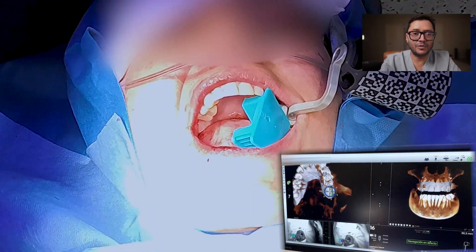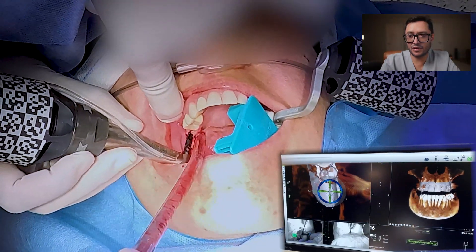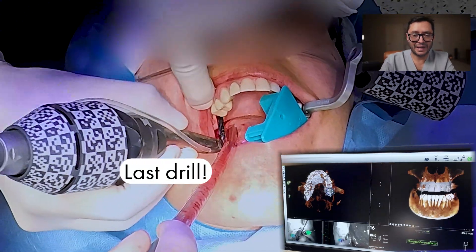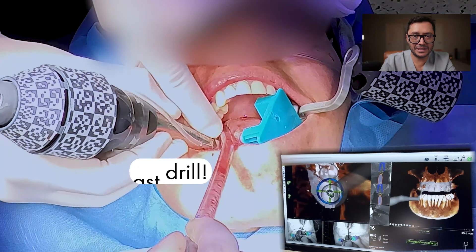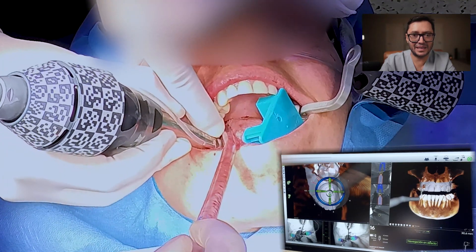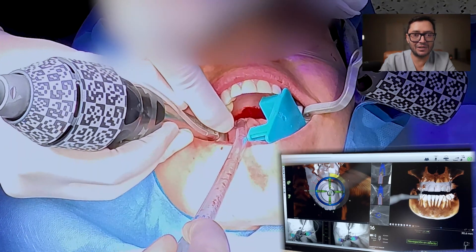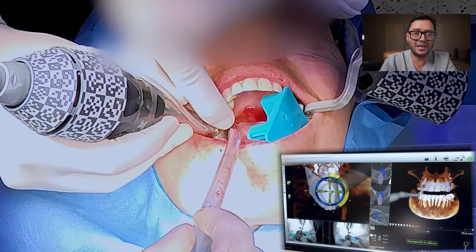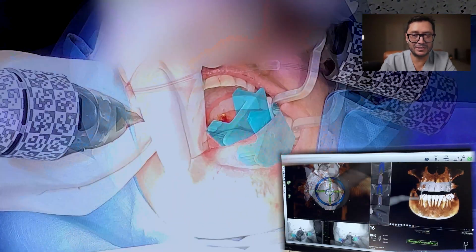One of the good parts of this kind of surgery is that it's minimally invasive, so we don't even have to make an incision. For this, I put the first drill and after that I take a biopsy punch, use it, and take out a small cylinder of the mucosa. Then I keep on over that with the rest of the drills.